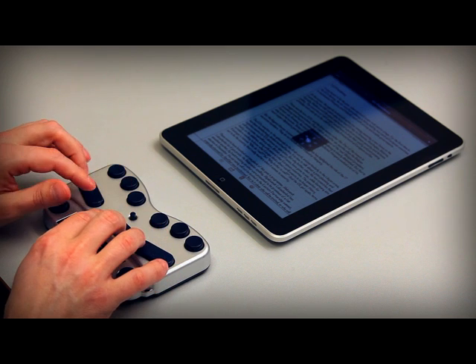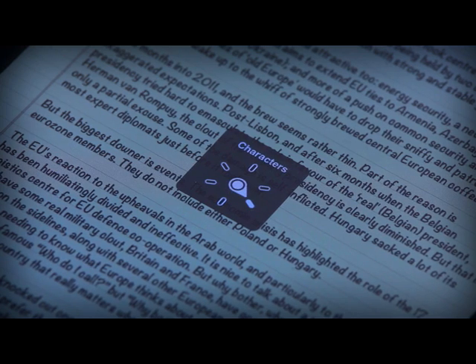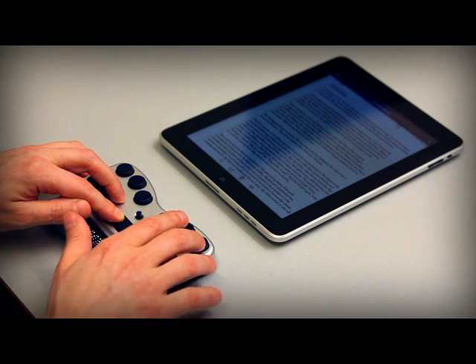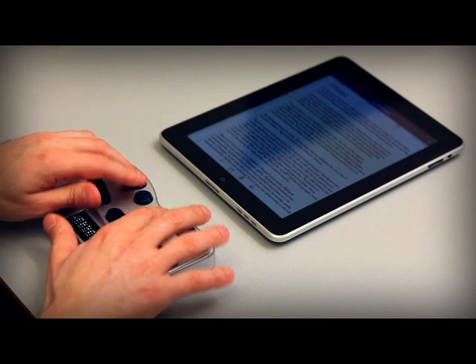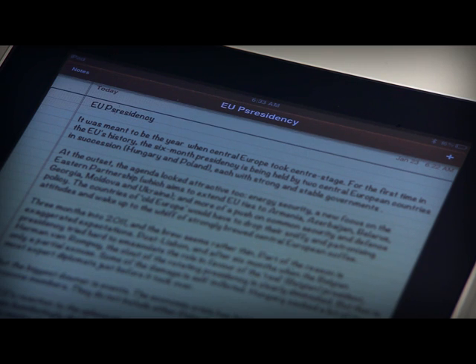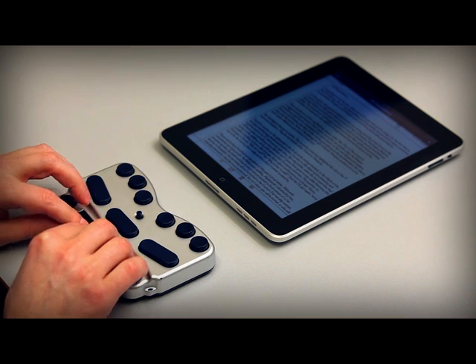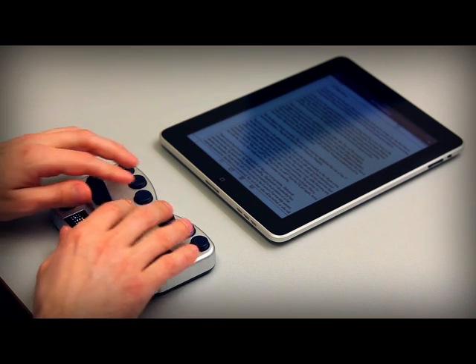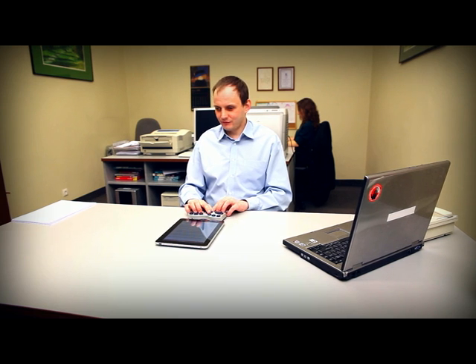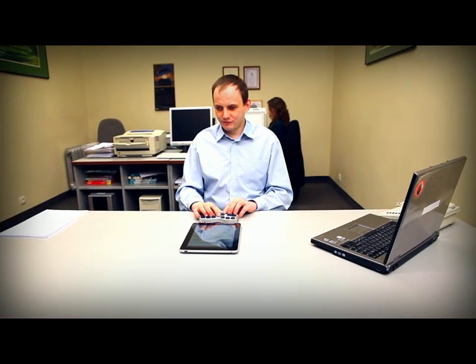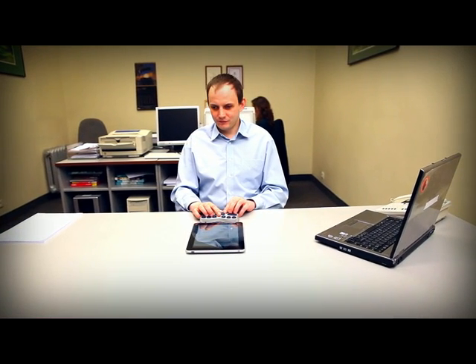If you want to edit your note, your rotor settings must be on character. Then you can move character by character and place the cursor wherever you want. To add text, simply type. To edit, you can use D chord — space plus dots 145 — to delete the character to the left of the cursor. With Braille Pen 12, navigating, reading, and particularly writing is much quicker and more intuitive.